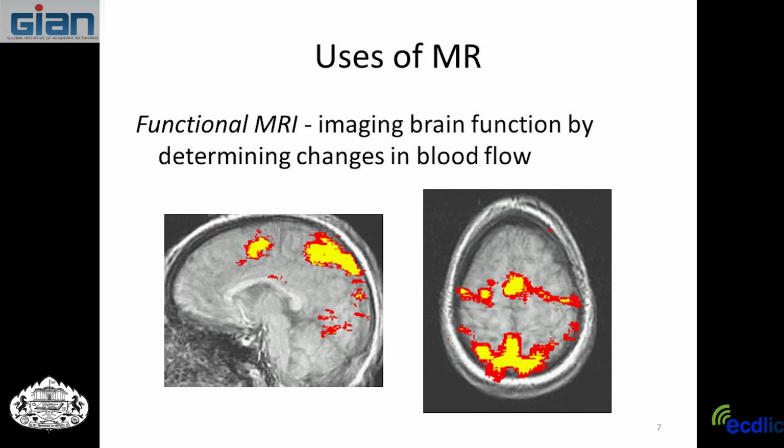Functional MRI began in the 1990s, and this technique has just really skyrocketed as a way to study the brain. It started very slow, and now if you search fMRI on Google, you'll get an incredible amount of hits for it. So it's become quite a popular technique.